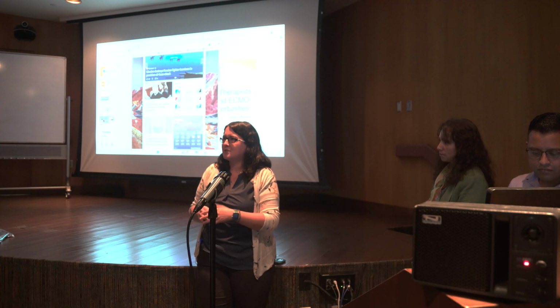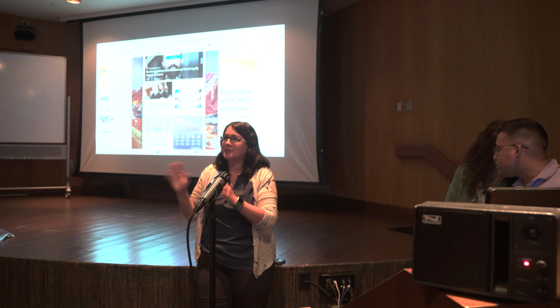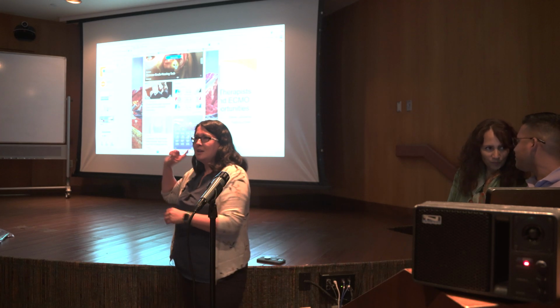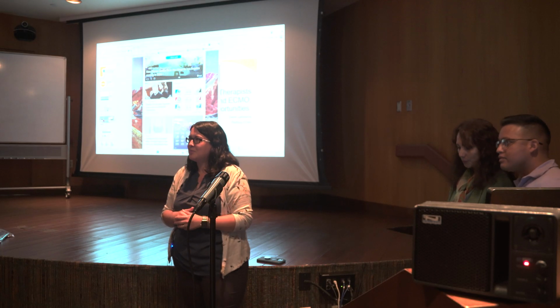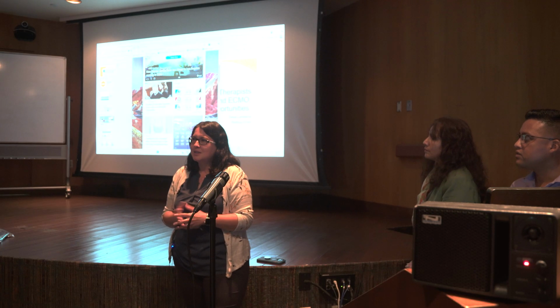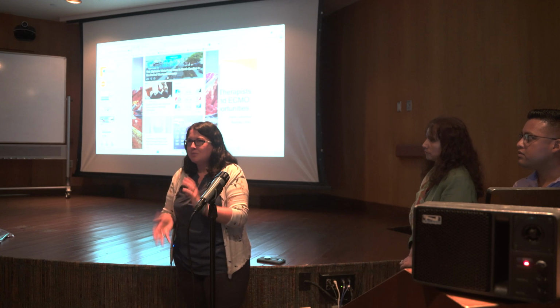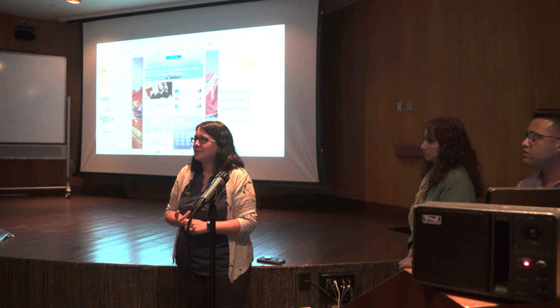And I want to have that conversation with my physicians too. And again, I have such a supportive physician team that is looking at those evidence-based things. And so us being able to do that is great. It might seem to you on that patient B where we were stuck on 18 of PEEP, they're like, oh, was that advantageous? It was, because it told us we're doing the right thing. And it helps us to keep some of that patience, because we know they just have to stay at 18 a little bit longer, right?